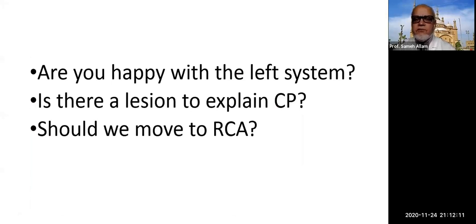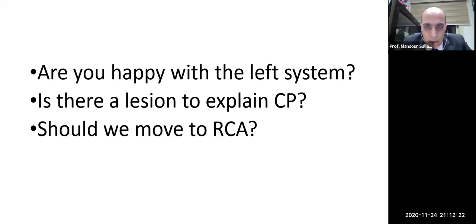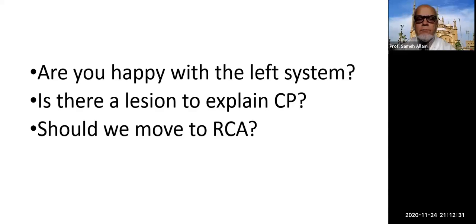Are you happy with the left system, Mansour? I couldn't appreciate any major issue, apart from tortuosity of the LAD, significant tortuosity. Okay.